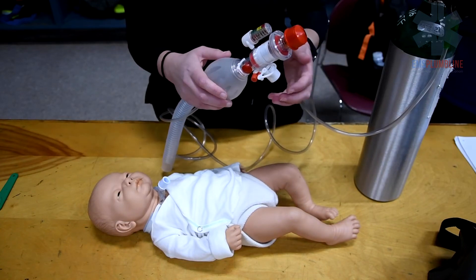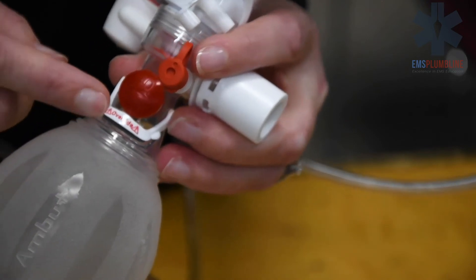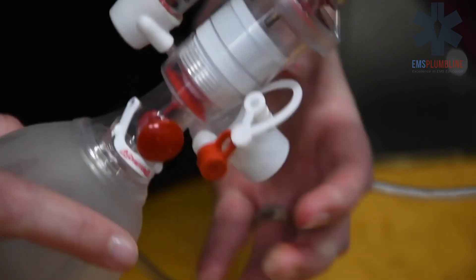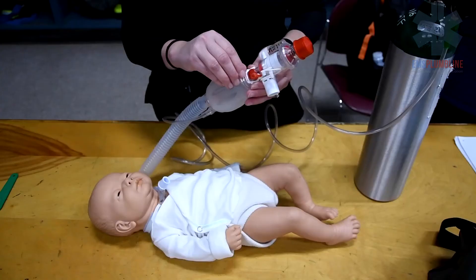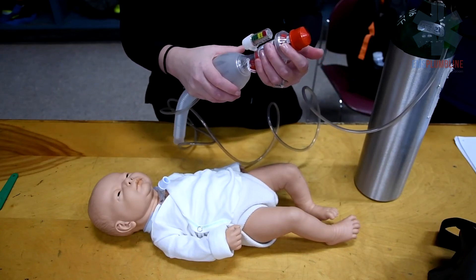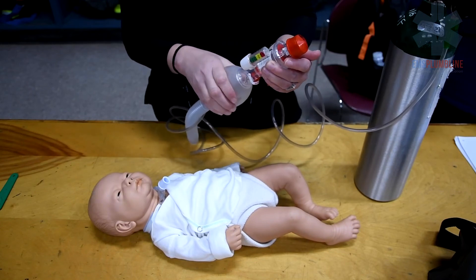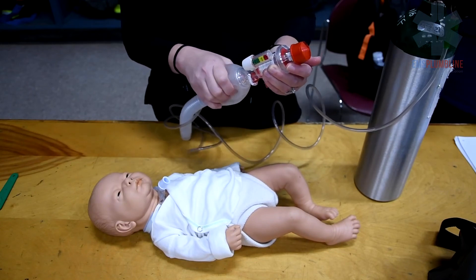A pop-off valve, or override valve, clicks on or off. This may be used when there is difficulty bagging the child and chest rise is not adequate. Turning the valve on will allow a higher pressure. Looking for appropriate chest rise when utilizing the override valve is important to ensure ventilation is being performed correctly.